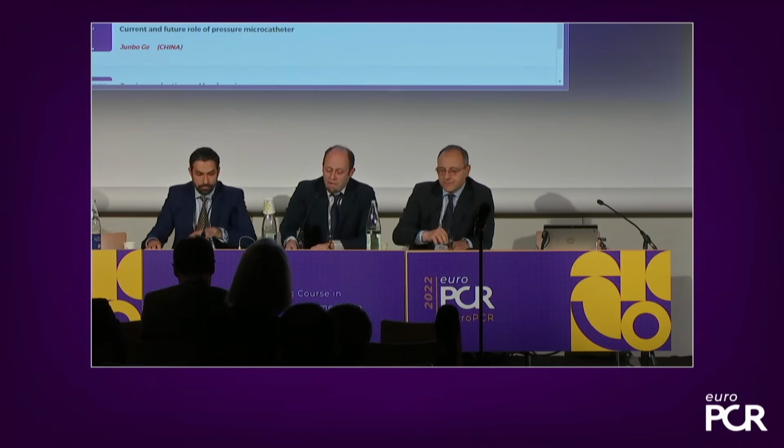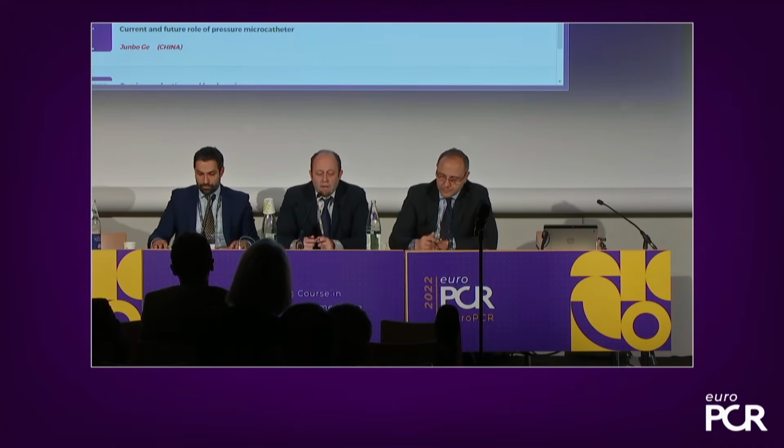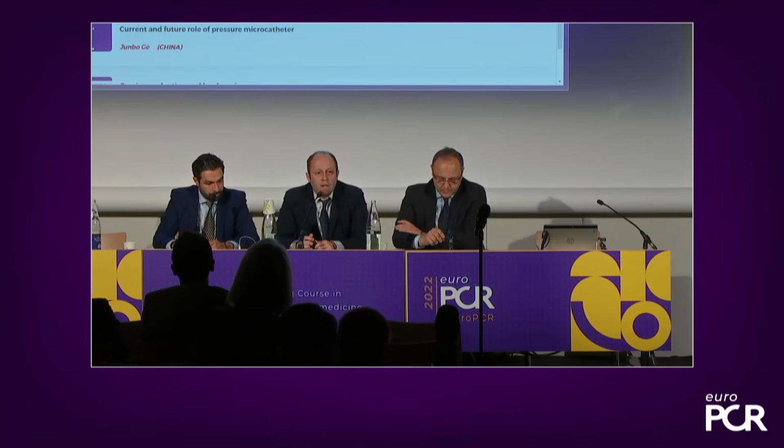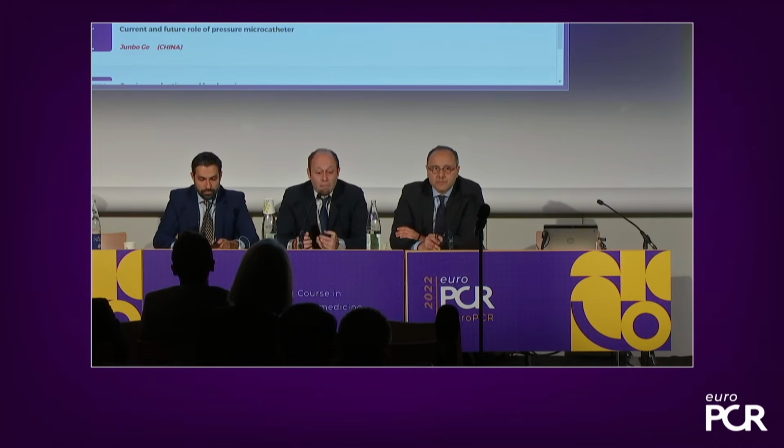Yes, this case is very interesting, and also in my opinion, we can start by the RCA because the RCA looks like the most severe stenosis. And my first step would be to stent just the mid portion of the RCA.